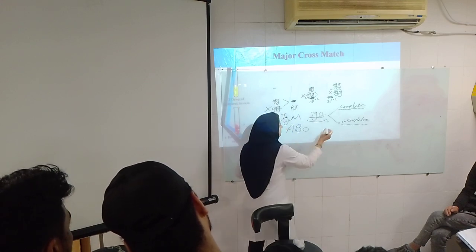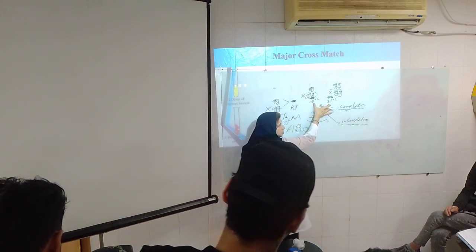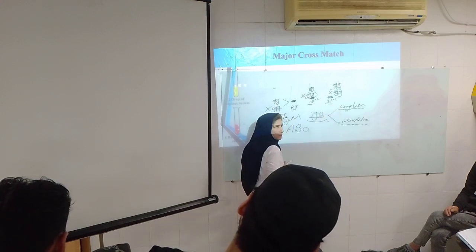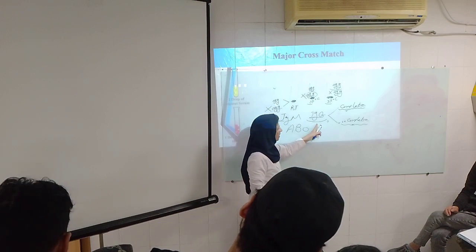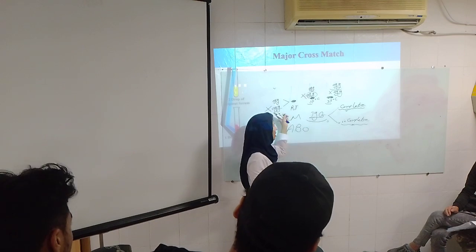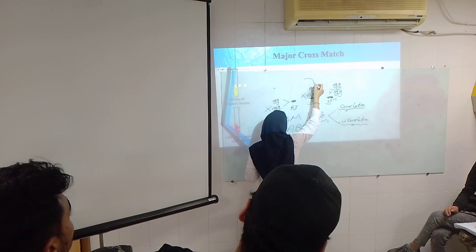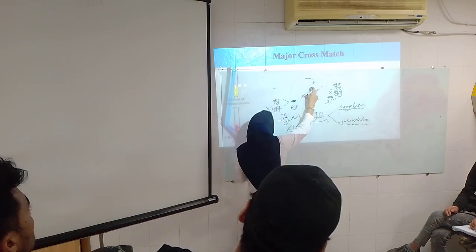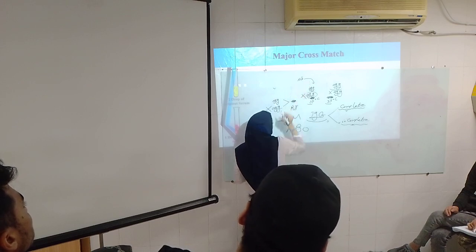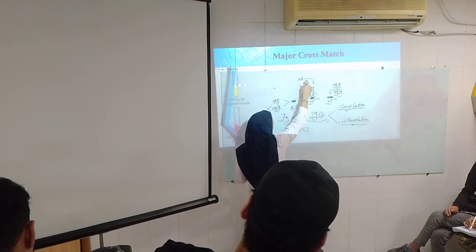Let's explain about complete and incomplete IgG and explain about these two tubes. We just warm them, and after that, for detecting these unexpected antibodies, because they are so weak in the plasma or on the RBCs, we need some extra materials. For the second tube, we add albumin. Because of that, we named this tube albumin.